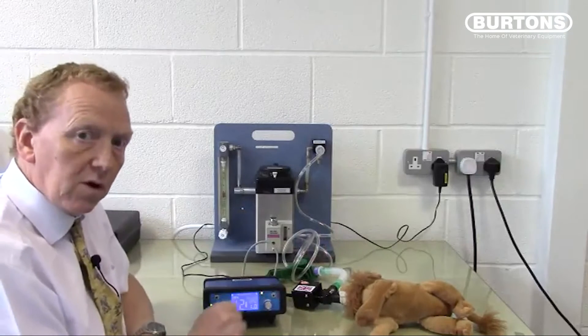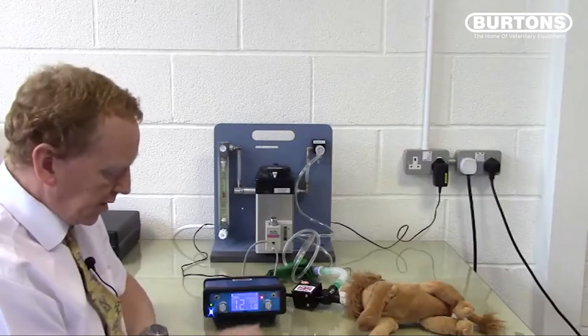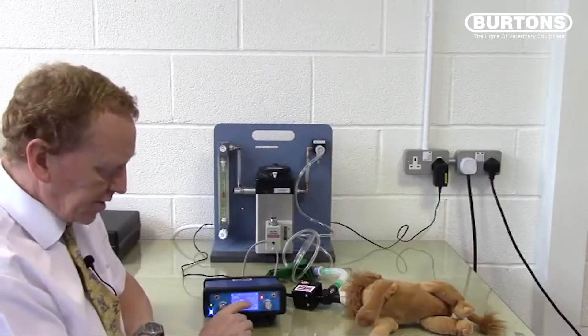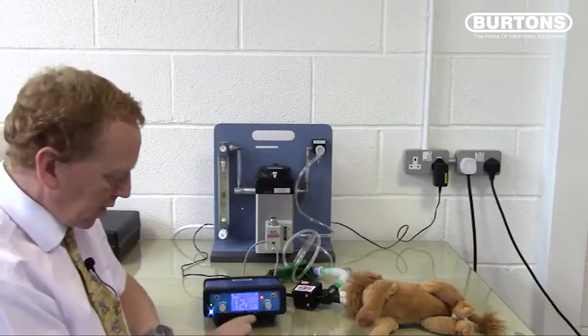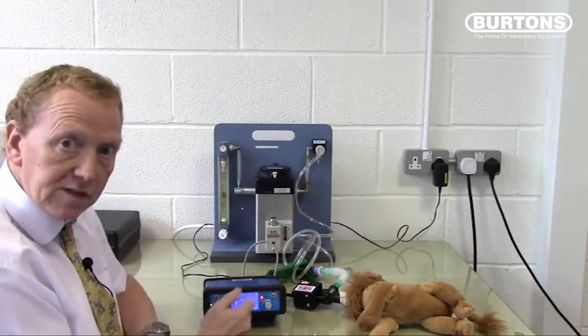A nice improvement of the SAVO4 over the SAVO3 is that we are now able to measure the inspiratory time. Because we know the inspiratory time, we can calculate the respiratory rate, and these are displayed on the screen.